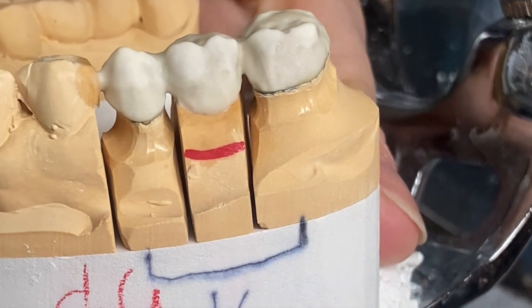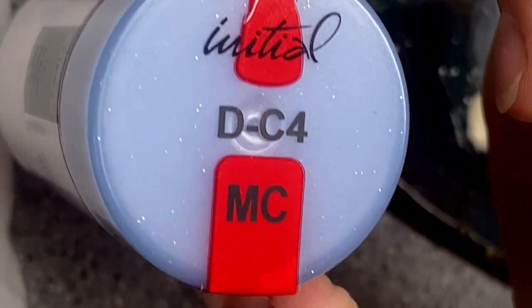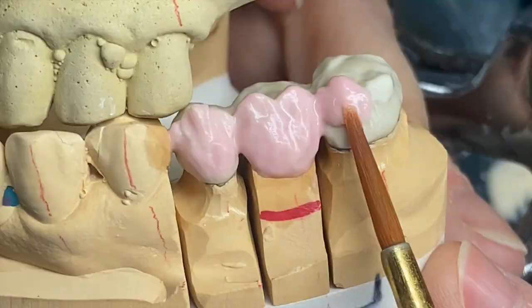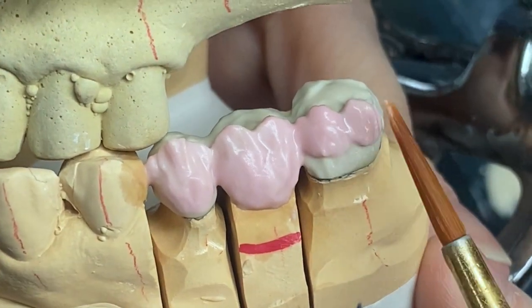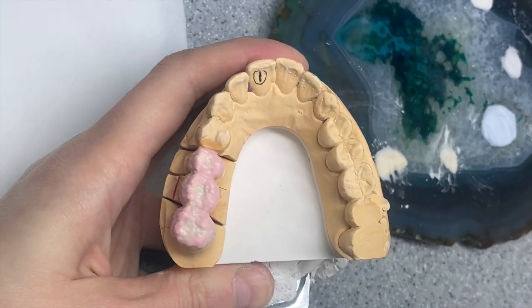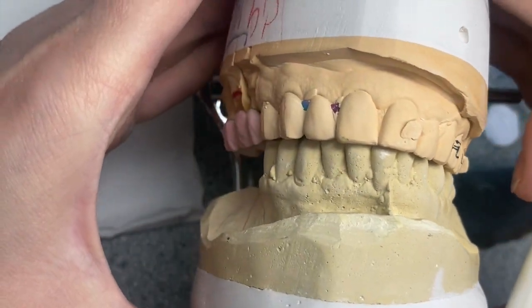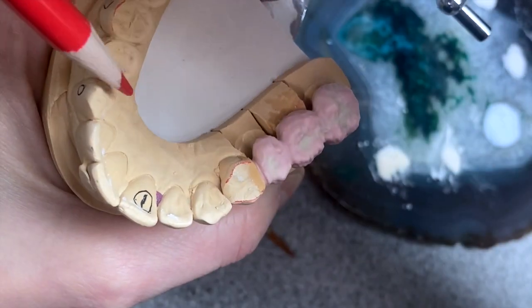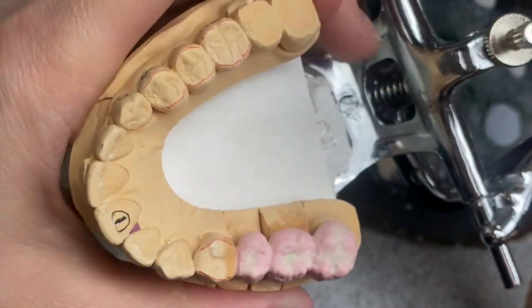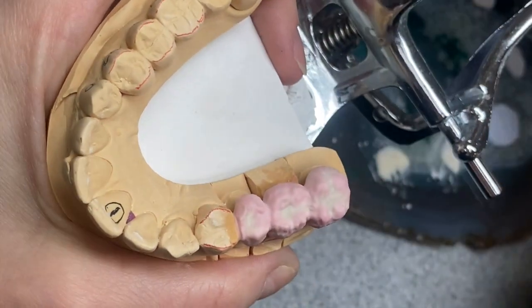Now I'm gonna apply dentine C4 — it's this one. You can see what the other side looks like. I'm seeing how wide my occlusion should be — it should be the same on both sides.